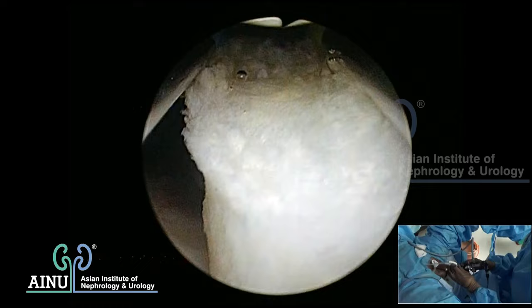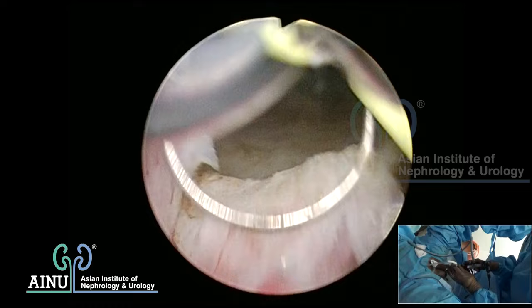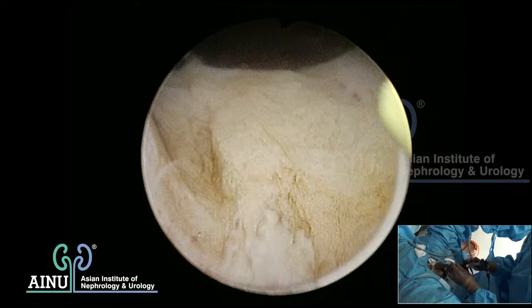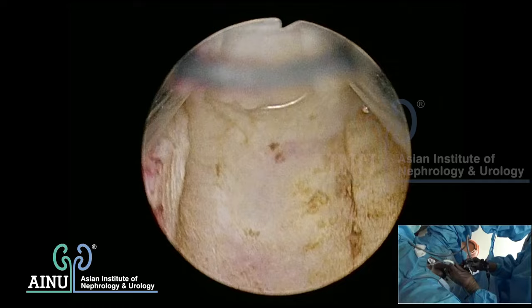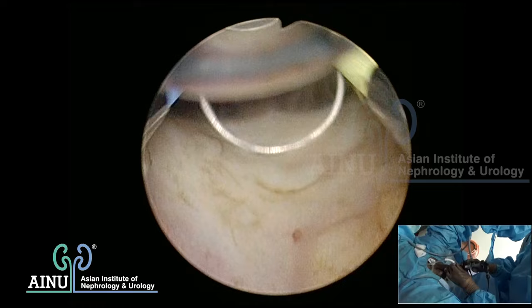The devascularized median lobe is being resected. This is a bipolar TURP - you can see the corona which cuts the tissue. It is not thermal energy but the corona which dissipates and cuts the tissue during the cutting current. That is the median lobe completed, with exposure of the bladder neck fibers. How do you know you've reached the surgical capsule? You start seeing an arborization of flat vessels running all across the prostate. Once you see those flat vessels running across, stop resecting - you have reached the surgical capsule.